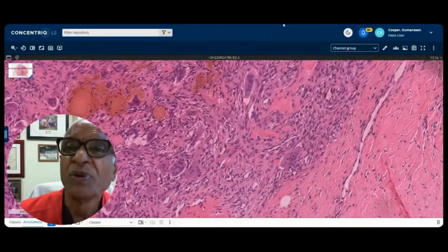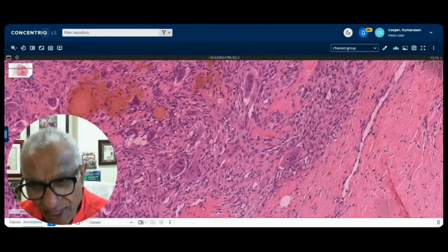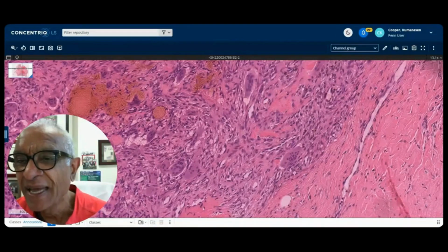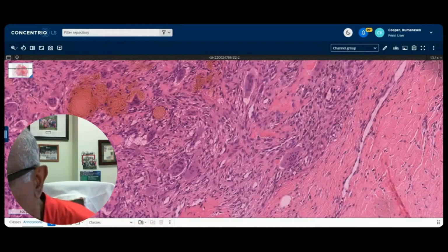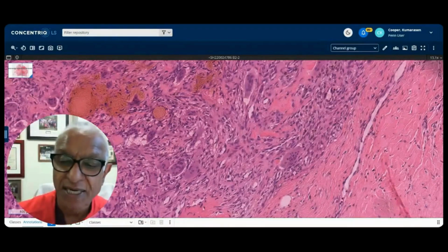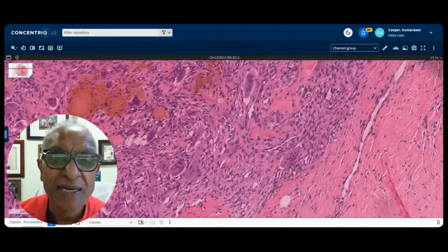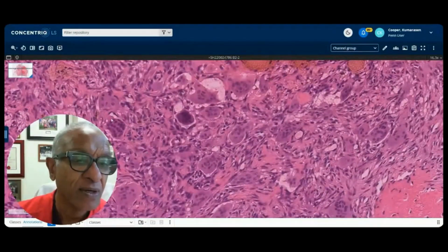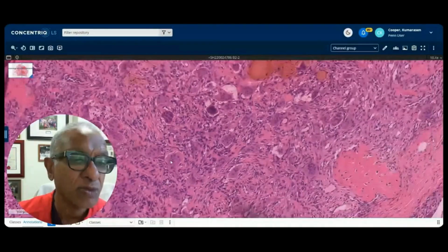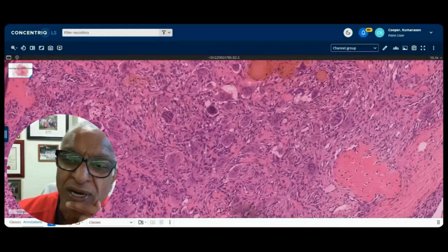So giant cell tumor of bone is a good thought. G34W being negative, ruling out the mutation of H3F3A. Giant cell tumor bone, solid ABC. Yeah, I like that. The nuclei in giant cells are too many, that's in the giant cell tumor of bone. Here, these are not that many, and these look much more like osteoclast-like giant cells. Some of them do have a greater number of nuclei, but in giant cell tumor of bone, it's the other way around. You get more giant cells with numerous nuclei and fewer osteoclast-like giant cells. This seems to be more dominated by osteoclast-like giant cells.